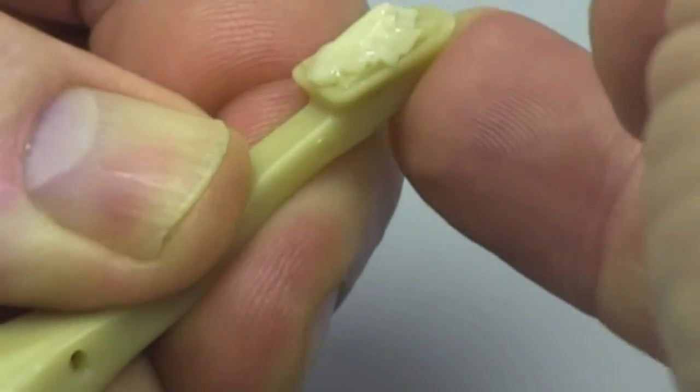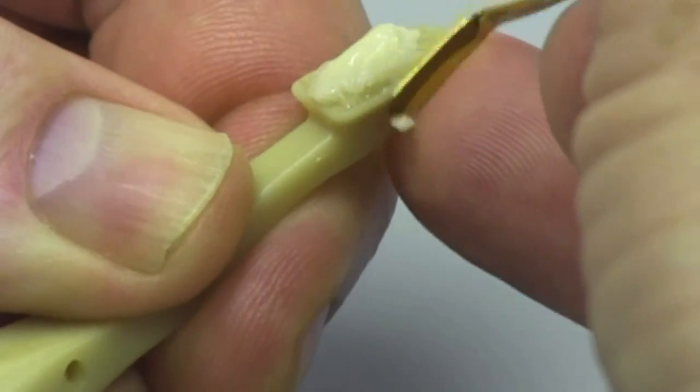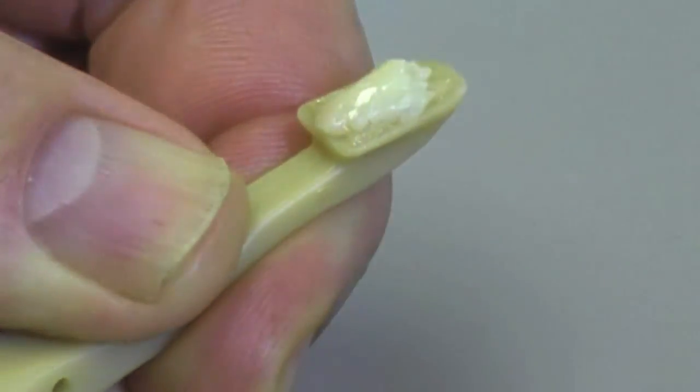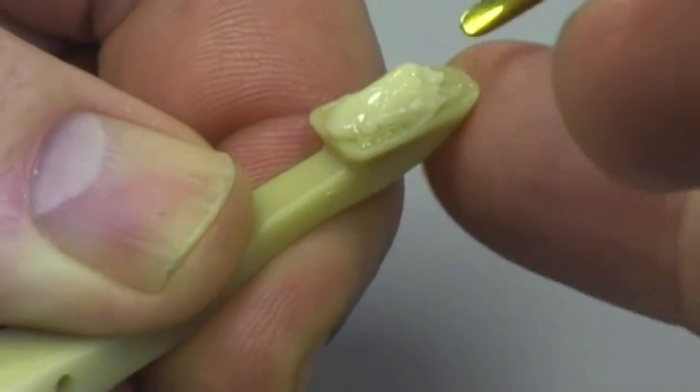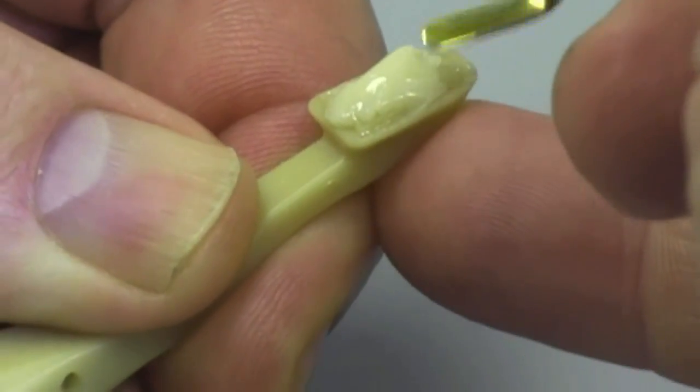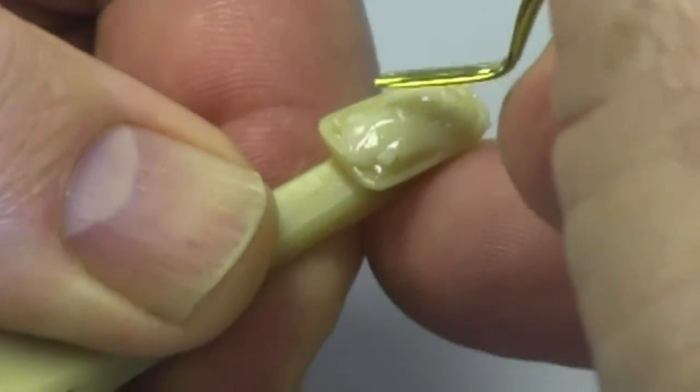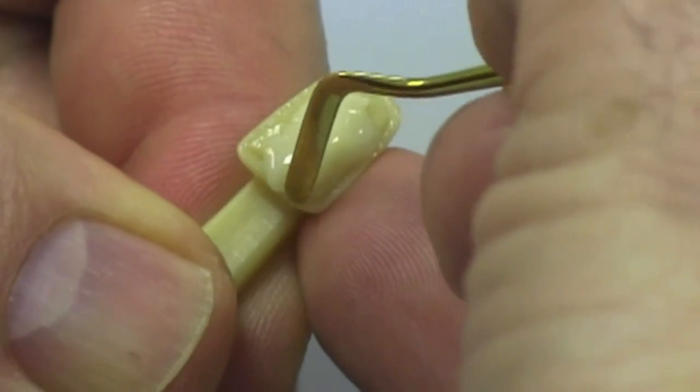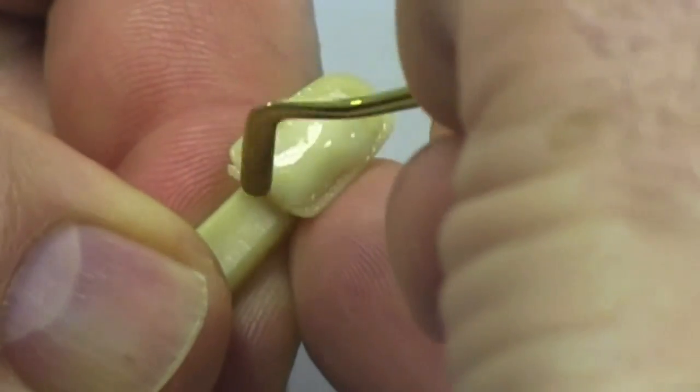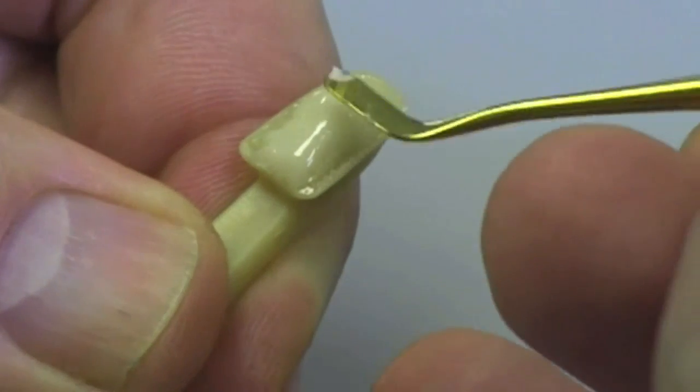I'm using a rather heavy instrument here. This is Cosmodent's broad-bladed or G3 instrument. It allows me to fairly rapidly achieve that effect of making that material seem very smooth and eliminate the chalky appearance completely.